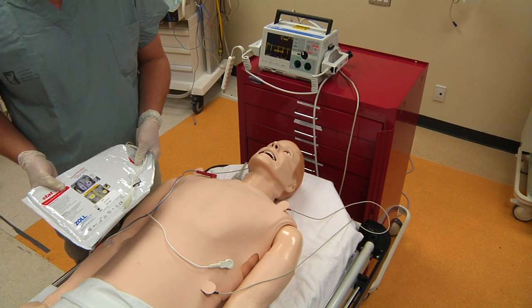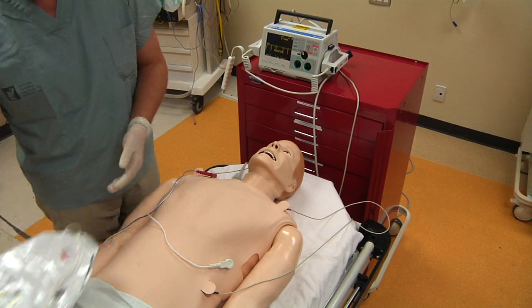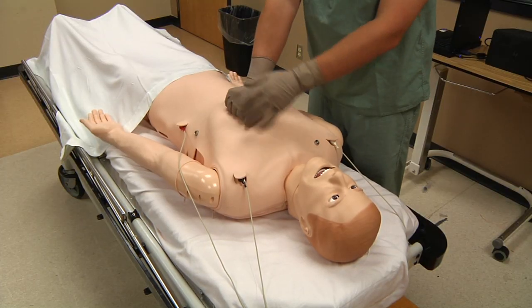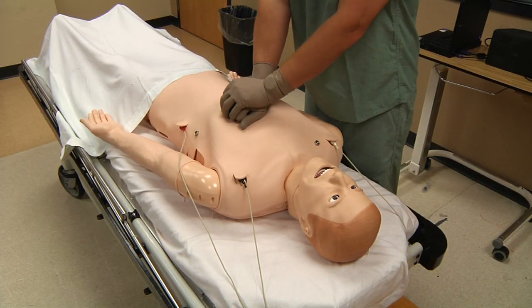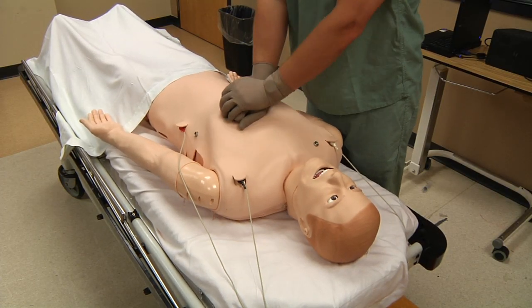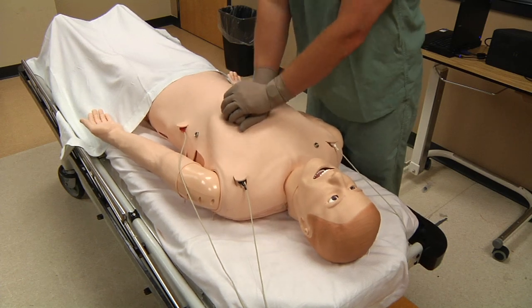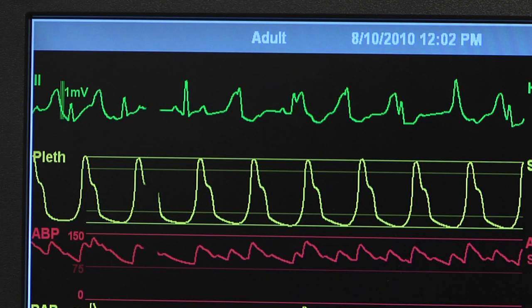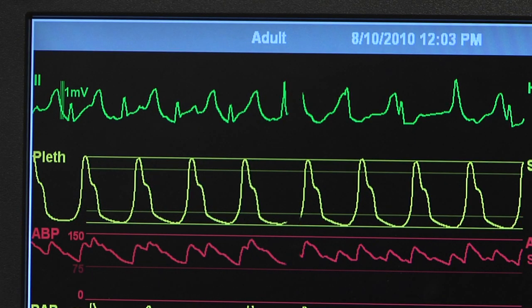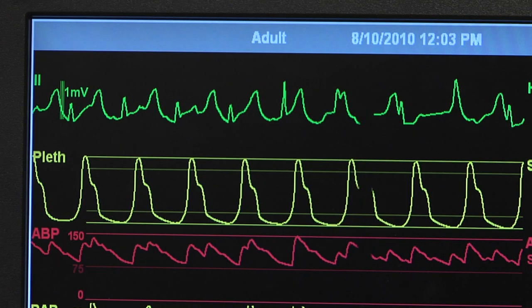When performing CPR, compressions will generate palpable pulses. Pulses and compression artifacts will be visible on the patient monitor.